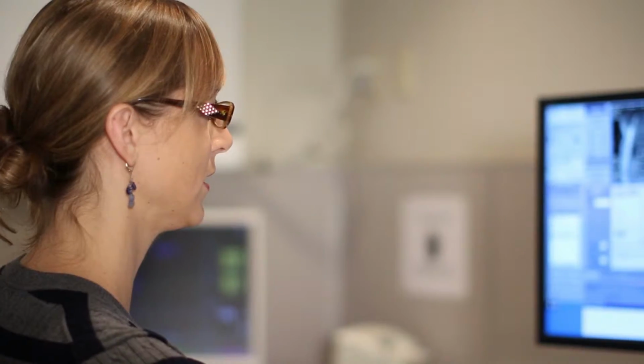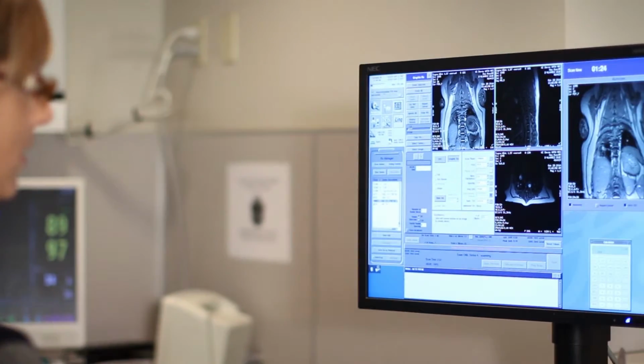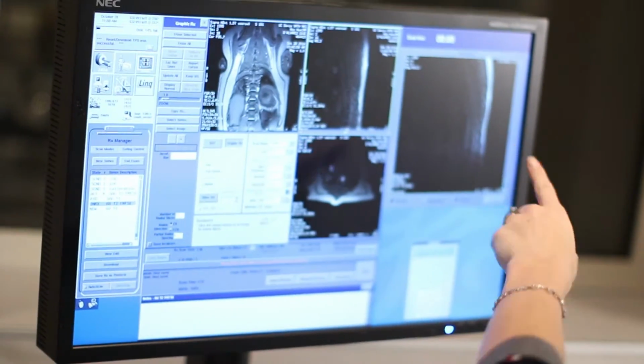Animal imaging in this portion of the shared resource is large animal imaging. That would include CT, or computed tomography, magnetic resonance imaging, or MRI, nuclear scintigraphy, ultrasound, and planar radiography. Since we are working with large animal models, these are client-owned animals that have spontaneous tumors. So we can provide researchers with access to human imaging capacity to look at animal tumors that are very similar to those that we find in people.